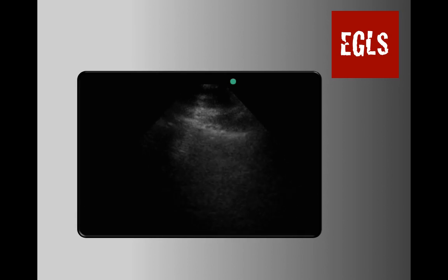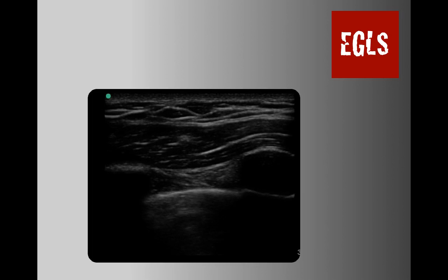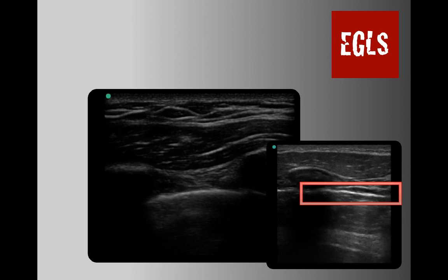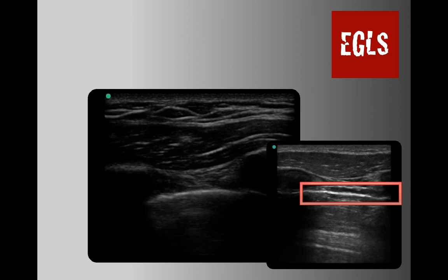Because lung sliding is kind of a shimmering, and it is going to be more difficult to see if you oversaturate the screen with too much gain. Here, do we actually see sliding? Yeah, we see it, but it might be kind of subtle, but it's definitely there. If you're not sure, look at this clip on the right here. Do you see lung sliding right there? Now, on the right, there's absolutely no lung sliding. We can see the difference with the 2 clips side by side.